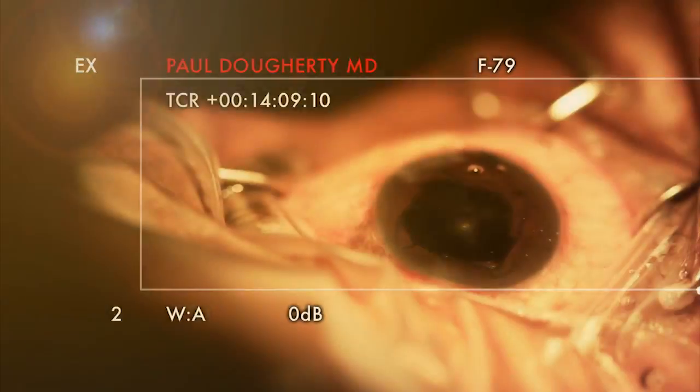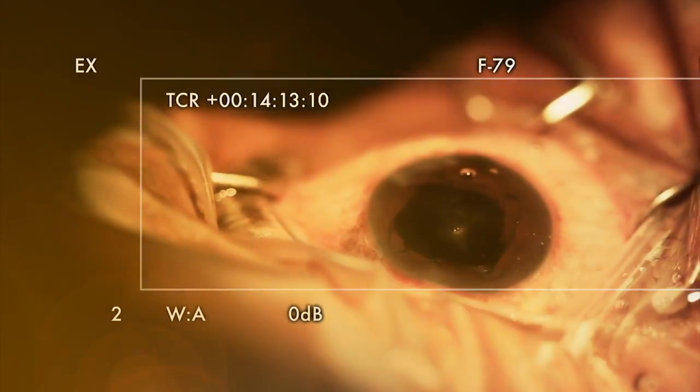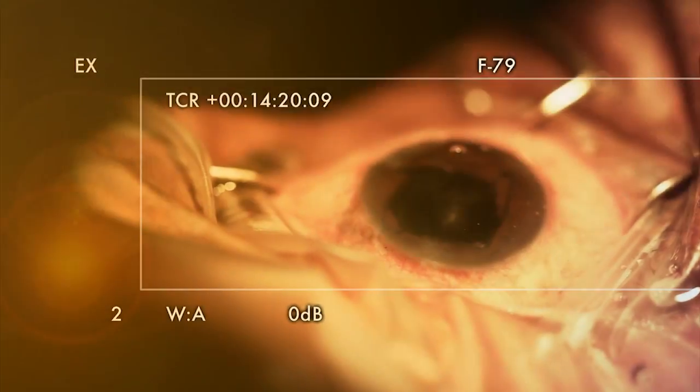Go ahead and load it. This was dense on the capsule — it was a fibrotic capsule and it was mature, but the nucleus wasn't so dense. So it was able to break up.